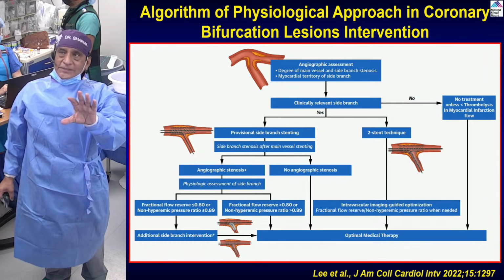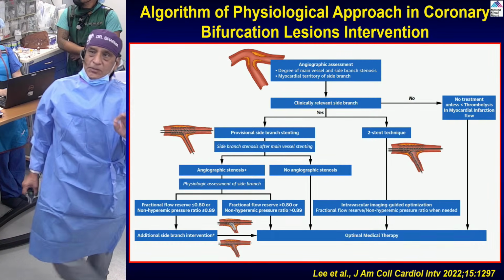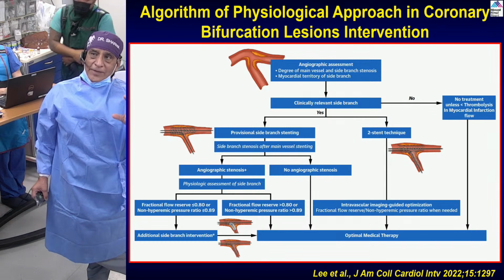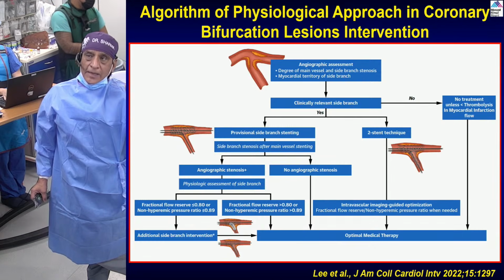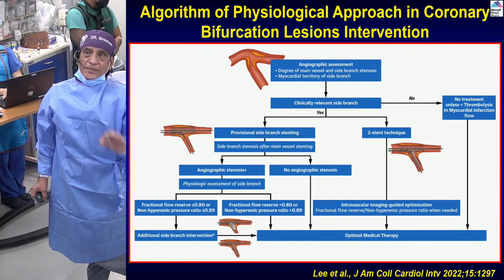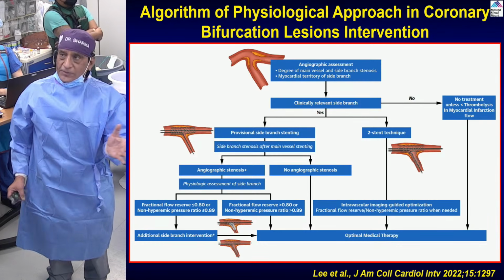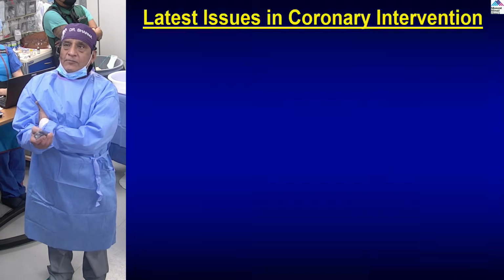We have provisional side branch stenting, and you can see here that they actually define angiographic stenosis, and you decide whether it is 60% or 80%; that is variable. So if you have a tight lesion after your stent with a one-stent provisional technique, and you try with a significant lesion, then you can decide based on the FFR or IFR. But I would say that, of course, if it is significant, whether you put a stent or not is always questionable. Randomized trials or other data have not shown benefit, but medical therapy is good enough for these cases.